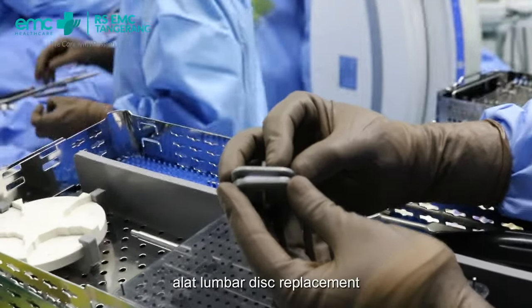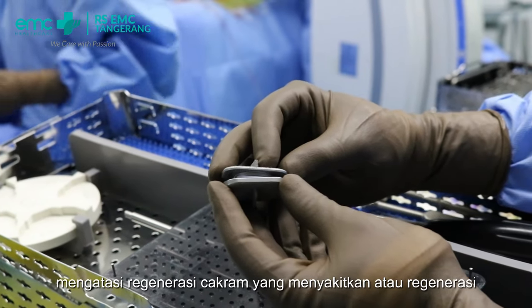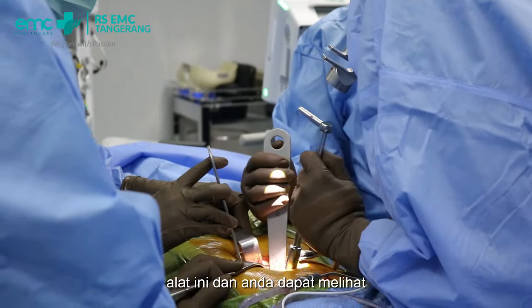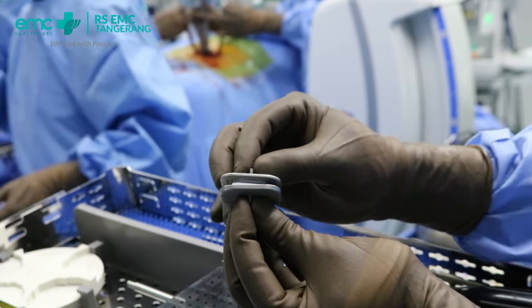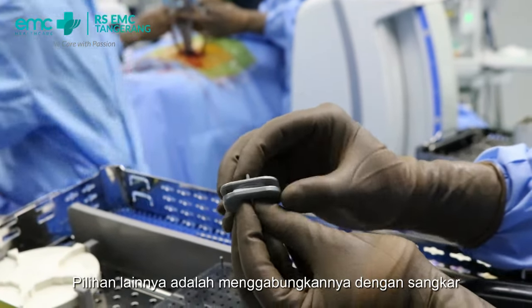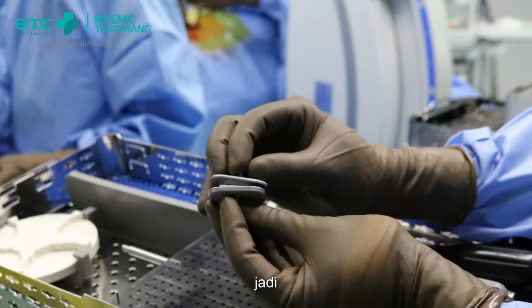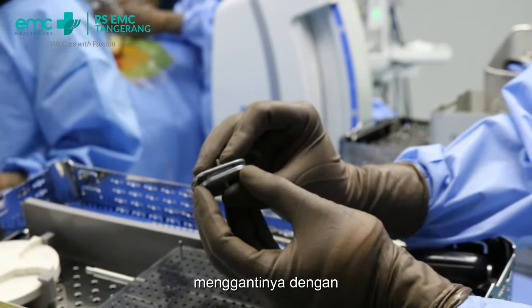This is the lumbar disc replacement device — one of the options to overcome a painful degenerated disc or large disc herniation in the lumbar spine. We remove all of the patient's disc and then insert this device. You can see it can move, which is why it's called lumbar disc replacement surgery or lumbar disc arthroplasty. People want their lumbar spine to be able to move, so when indicated, we should replace it with this kind of device rather than a fusion cage.